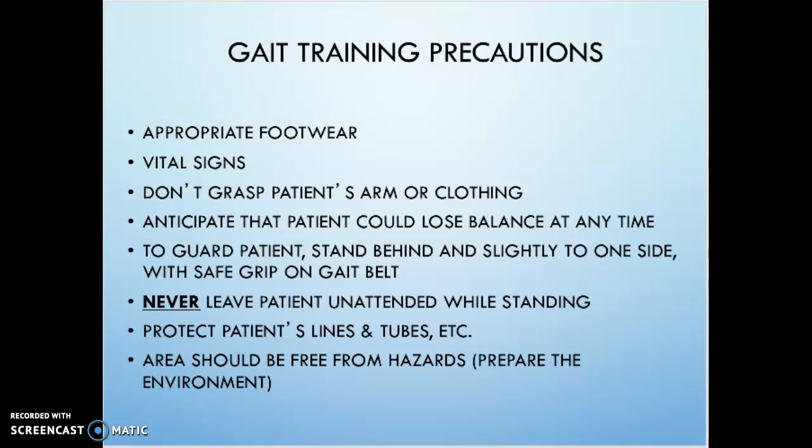Of course, we want to typically be on the involved side of the patient. So if they have a right knee surgery, a right ankle surgery, a stroke that affects the right side, we are going to be standing on the right side, slightly behind the patient, and that palm-up grip on the gait belt. Never leave a patient alone while standing or walking.